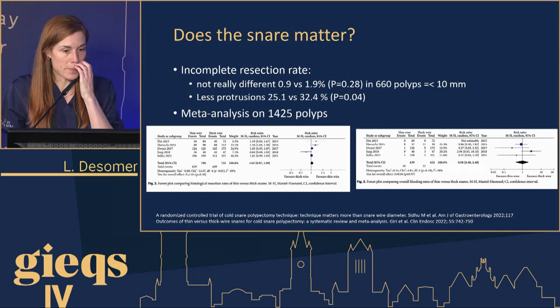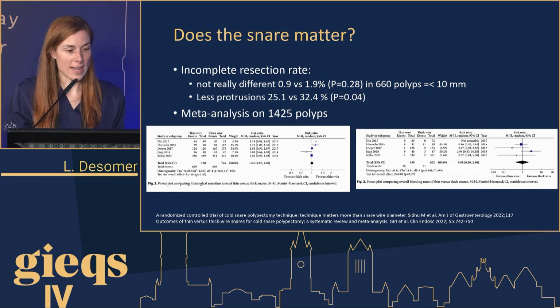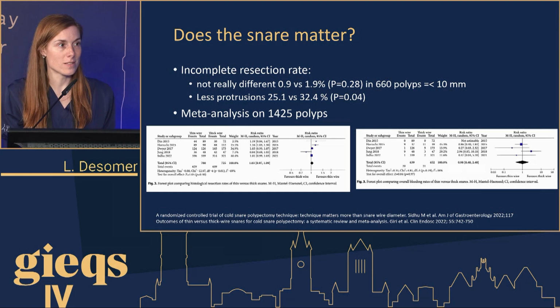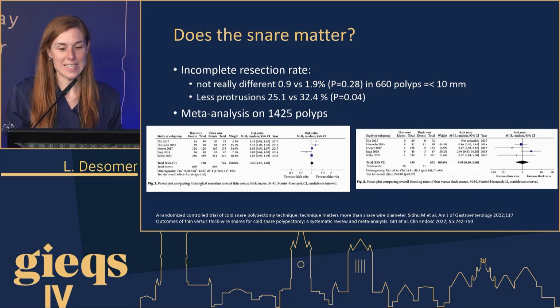So does the snare matter? Do we need a dedicated cold snare? Can we use a standard snare? Do we need to open two snares in one procedure? They're all very economical and environmental things we have to bear in mind when we make these decisions.